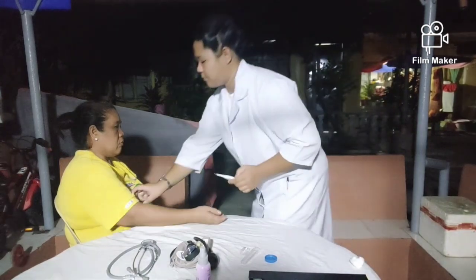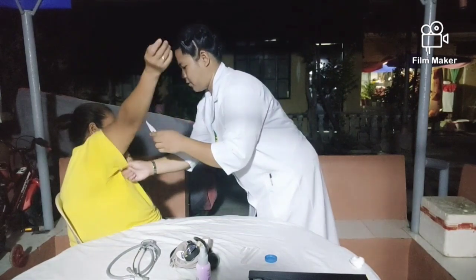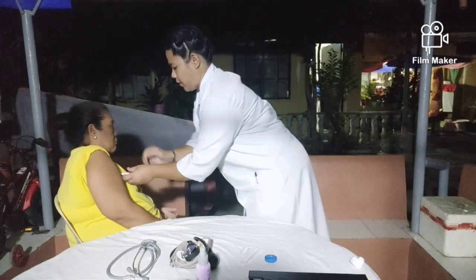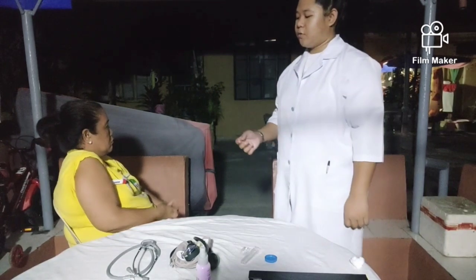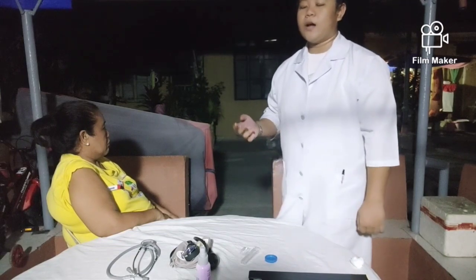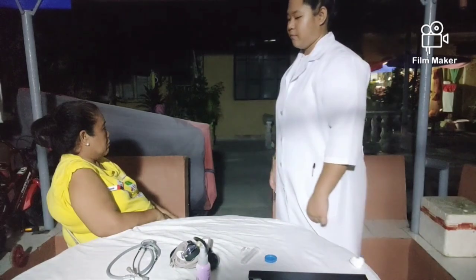Then, after you put the thermometer under the axilla of the patient, wait for the right amount of time to get the right temperature.